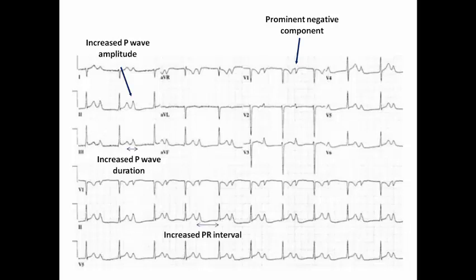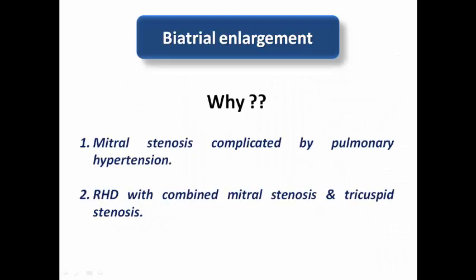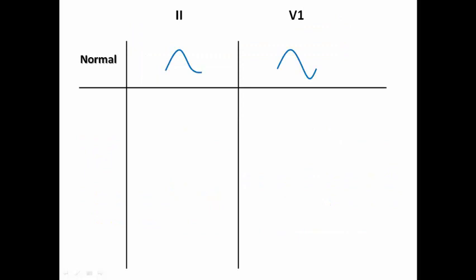Additionally in this example there is an increased PR interval with one-to-one conduction, indicating first-degree AV block. These patients have biatrial enlargement associated with first-degree AV block, and echocardiography should be performed to look for structural heart disease — for example, infiltrative cardiomyopathy. Causes of biatrial enlargement include mitral stenosis complicated by pulmonary hypertension, or rheumatic heart disease with combined mitral and tricuspid stenosis.